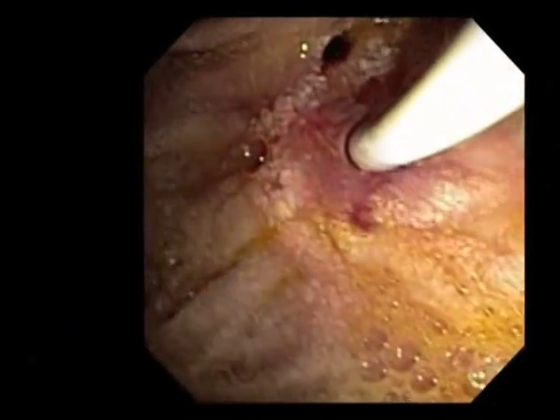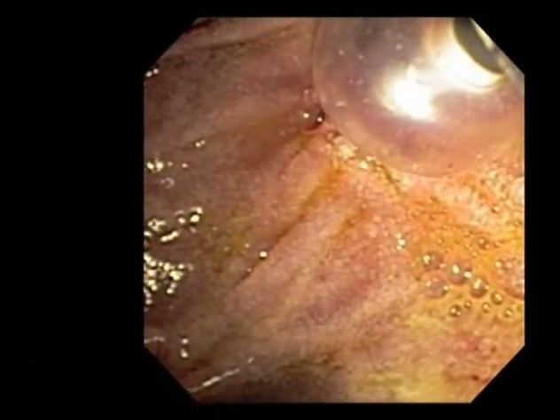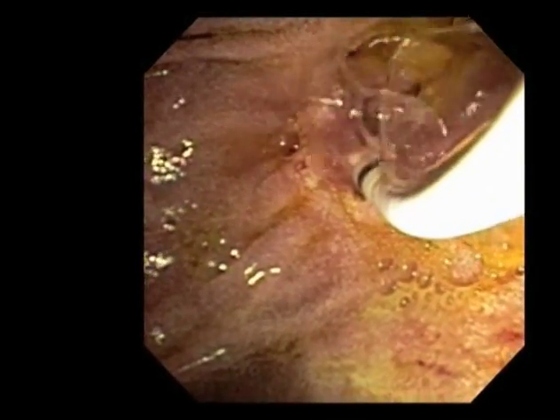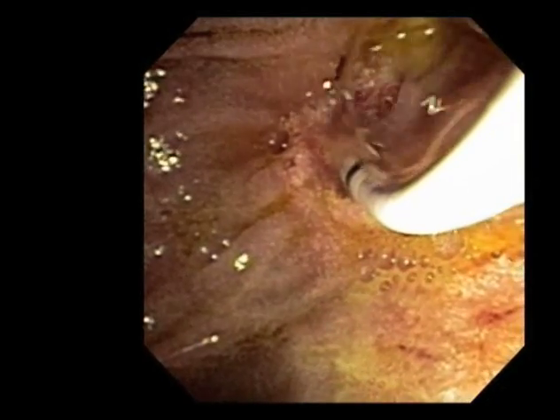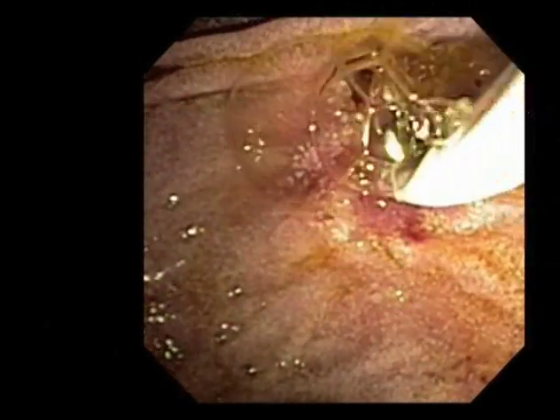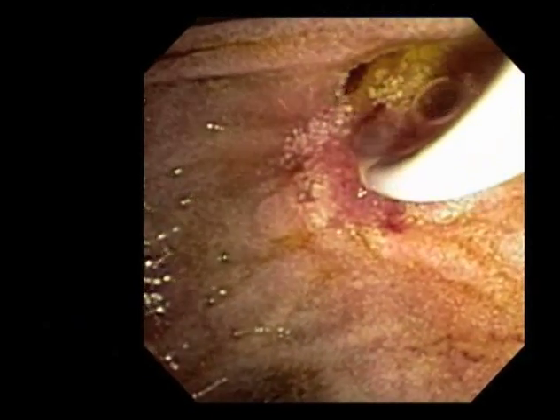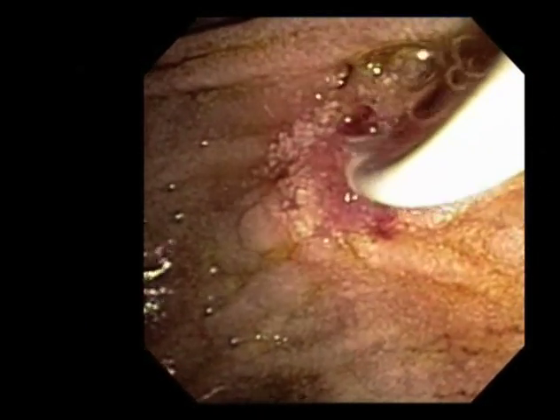Note the large stone to the right of the screen. The duct is repeatedly swept in an effort to clear all sludge, stones, and debris.